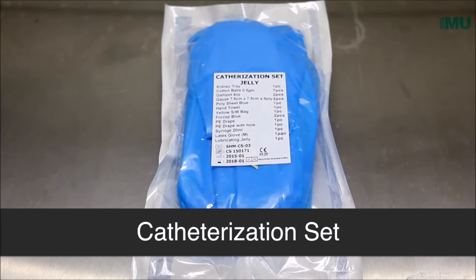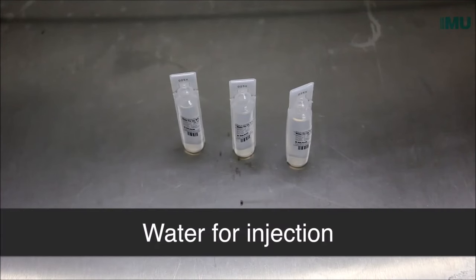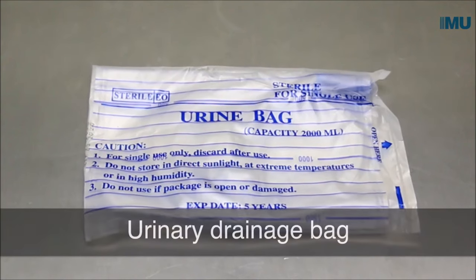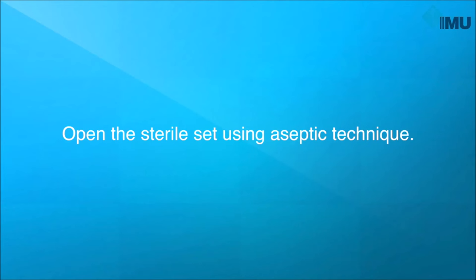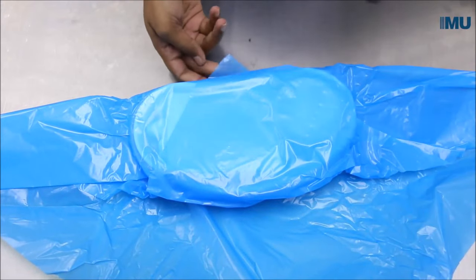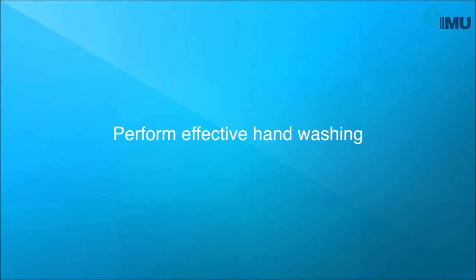To perform this procedure, you will need a catheterization set. Open the sterile pack using aseptic technique.